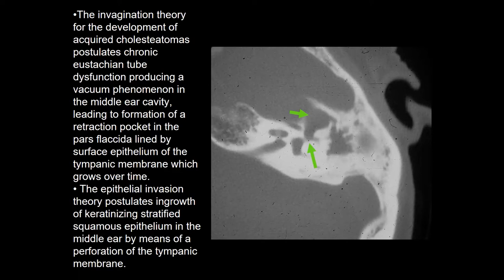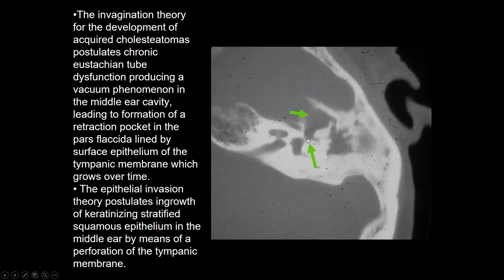In any case, what we typically see is opacification of middle ear structures and erosion of middle ear structures. As you can see in the anterior epitympanic space, there is loss of the bony confines. In this example, we see the cholesteatoma fistulizing to the lateral semicircular canal anterior crus — an example of a perilymphatic fistula from cholesteatoma in the anterior epitympanic space to the semicircular canals.